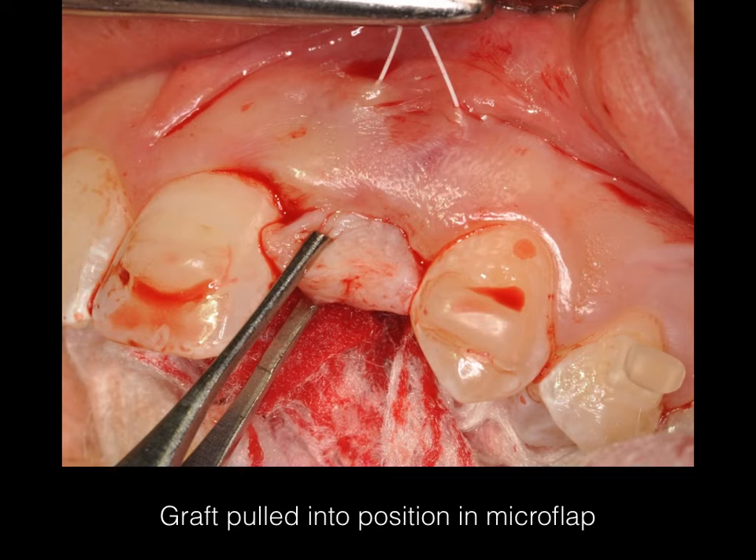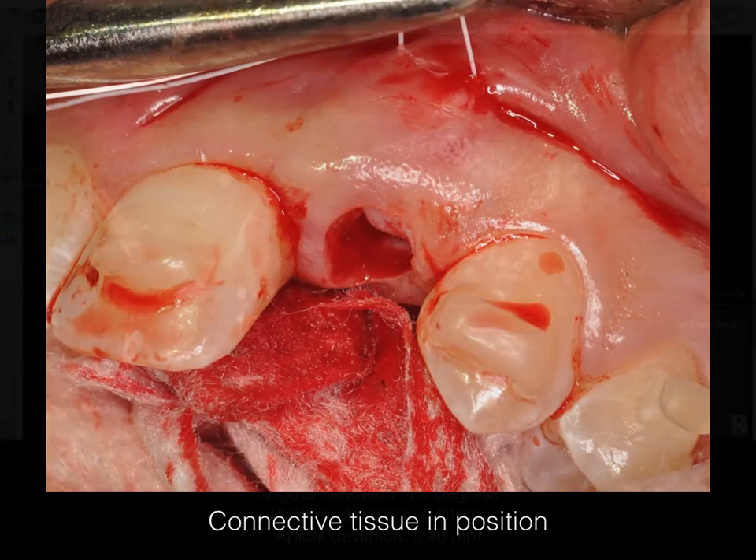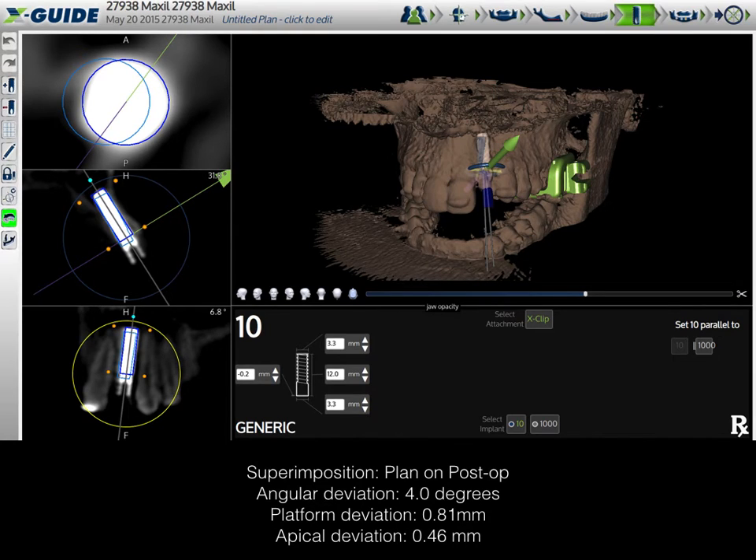Again, this is a high-risk case — you couldn't do this case without guidance, not without high risk. After the graft is done, we can tweak the position of the implant because we're using a parallel wall implant. We can force the final view of the implant with the X-Guide and check the depth. The post-operative superimposition of pre-op and post-op shows my angular deviation from the plan was 4 degrees, my platform deviation was 0.81 mm, and my apical deviation was 0.46 mm. This is within the accuracy and precision you would expect with a static guide, but with the flexibility you would not get with a static guide.